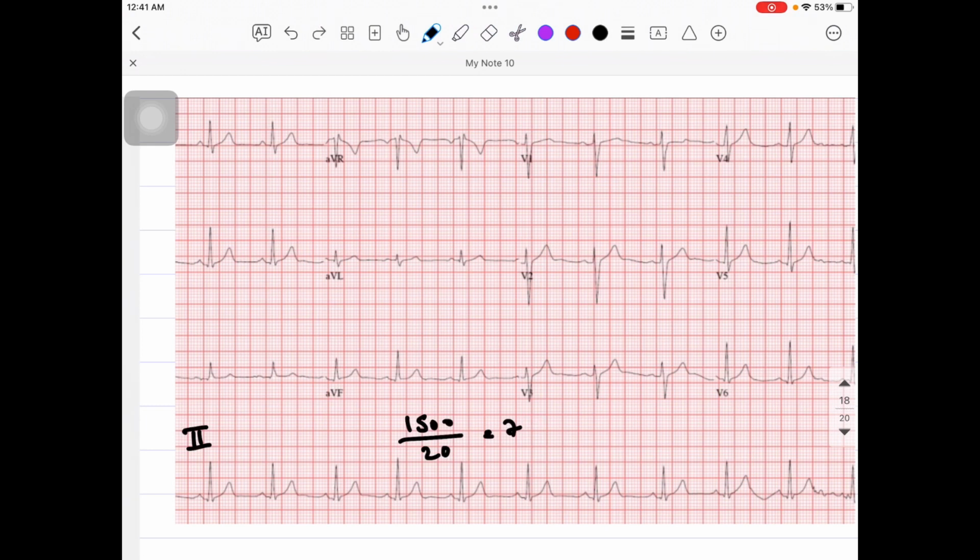And if you are aware of the previous video as well, guys, I have talked about atrial flutter versus fibrillation, where I told you that in atrial fibrillation the patient will be having an irregular rhythm. How to calculate the heart rate in that scenario also we have talked about. So that is the thing.